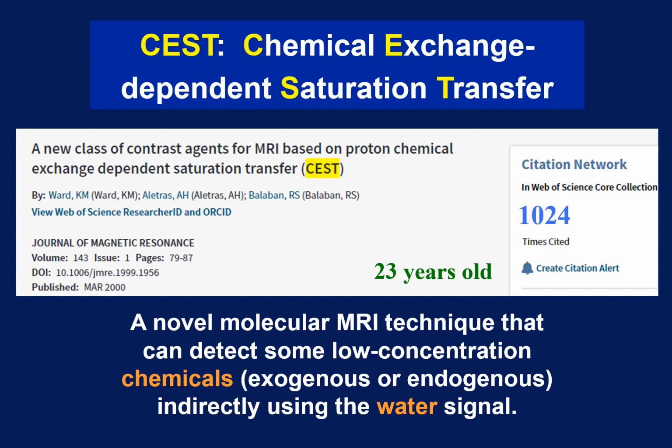CEST is chemical exchange dependent saturation transfer. This technique was proposed by Ward and Balaban at NIH in the year 2000, so it's almost 23 years old.